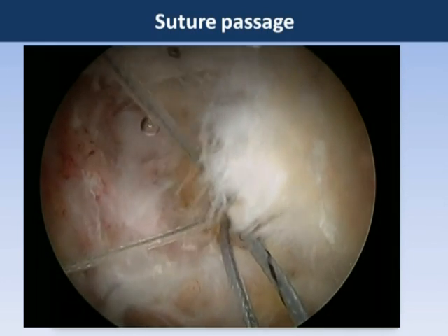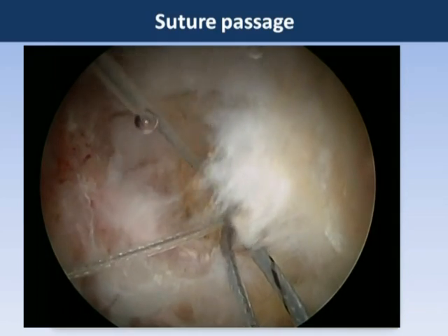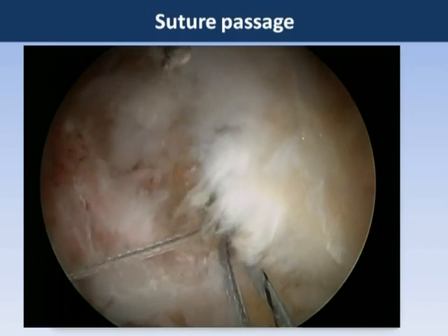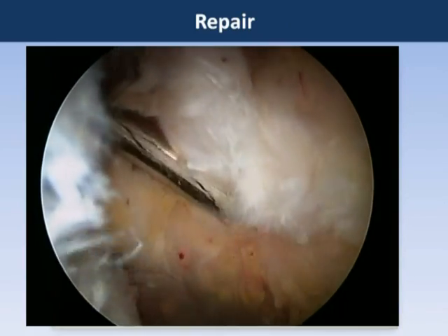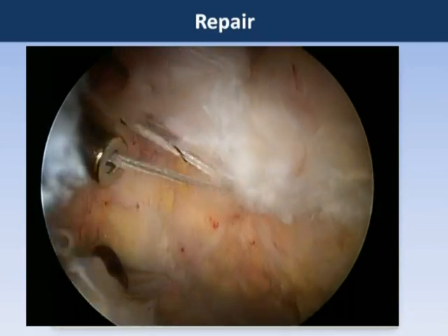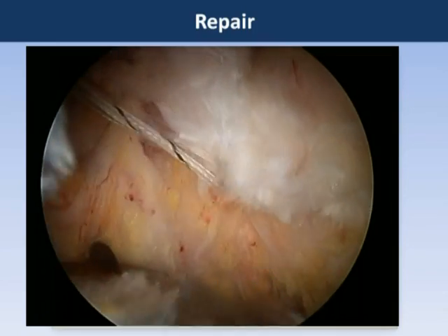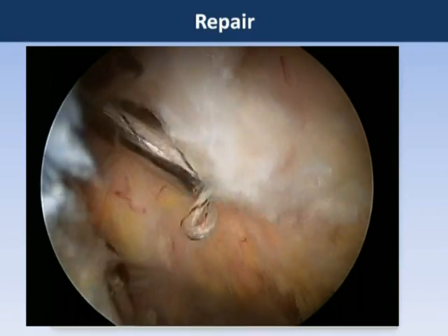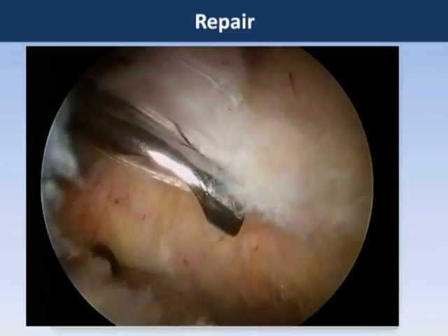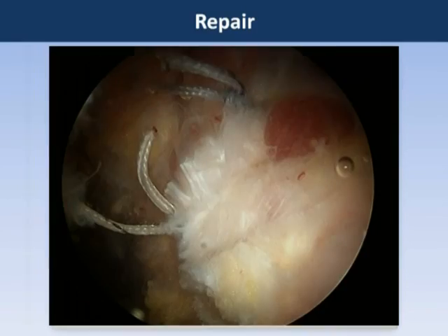We have passed one limb of the suture through the tendon in the anterior part at the top of the screen. Having now completed the passage of all four limbs of suture, we tie these side-to-side knots using standard arthroscopic knot tying technique. This is done through the posterolateral portal while viewing through the distal peritrochanteric portal.